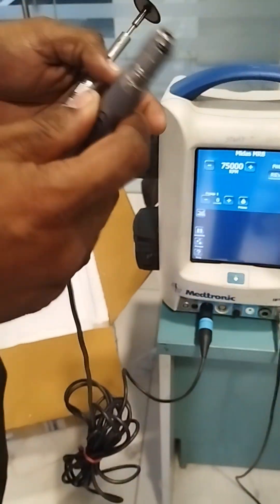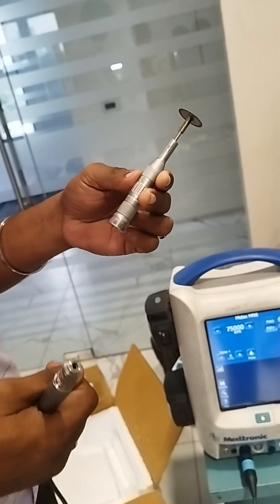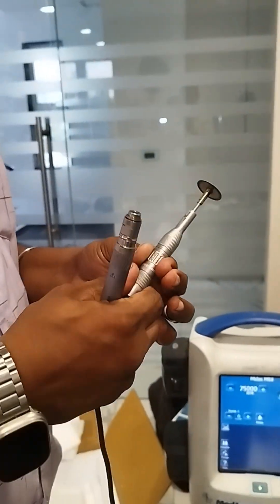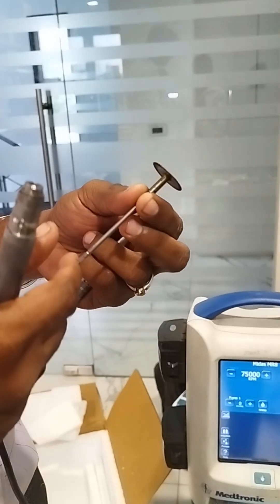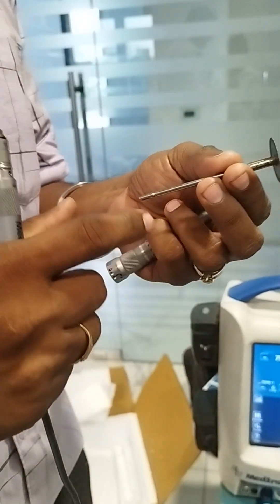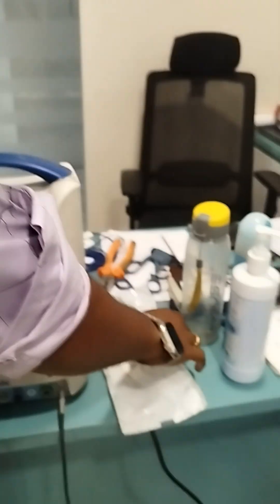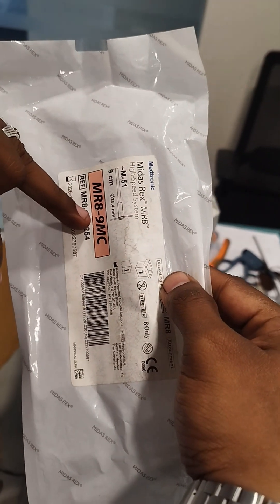Good evening friends. Now I am going to demonstrate the MR8 motor with metal cutter attachment. This is the metal cutter attachment and this is the metal cutter tool. There are two tools: one is for cutting the metal and another one is to file the tool, so those will be different. This metal cutter tool will come in a pack mentioned as MR8 9 centimeter metal cutter.